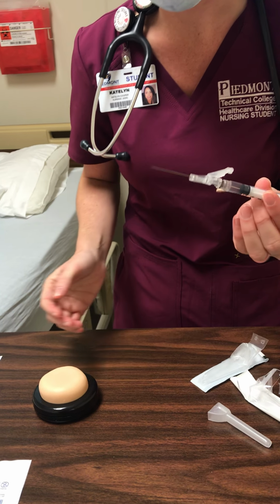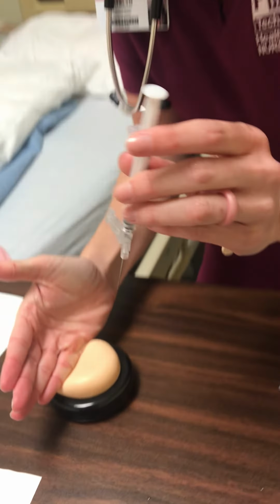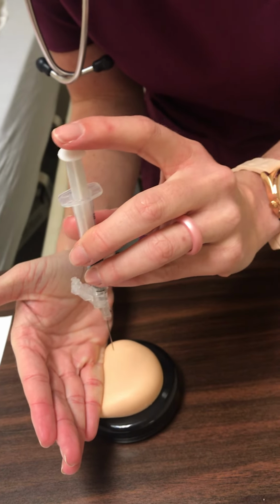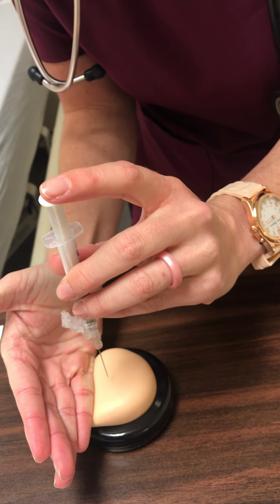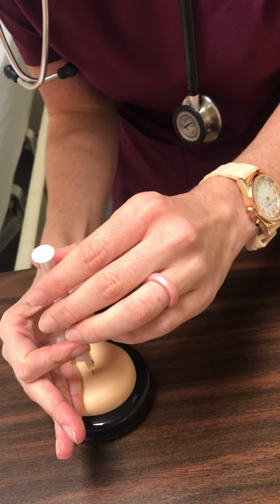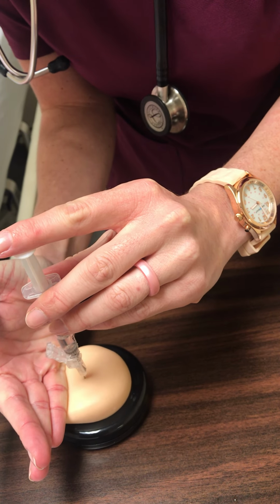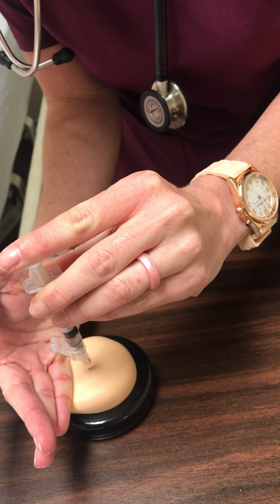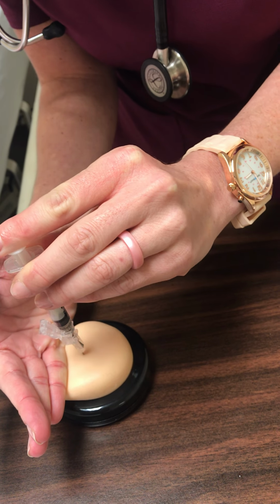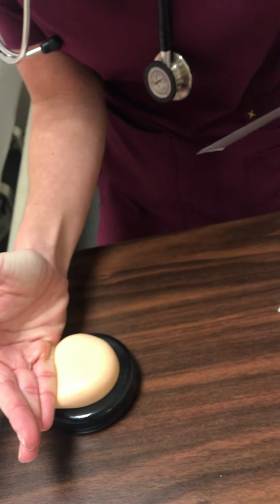Now I'm going to make sure that my bevel is up. I'm going to use the Z-track method and retract the skin laterally. Again, like I said, the bevel is up. I'm going to inject at a 90-degree angle. And I'm going to aspirate for blood. And I do not see any blood. So now I'm going to gently push the medication in. And I would hold that there for 10 seconds. I'm going to retract my needle and retract the skin.